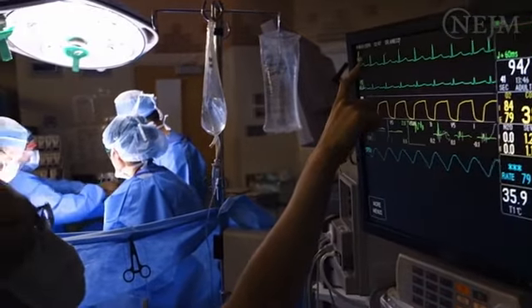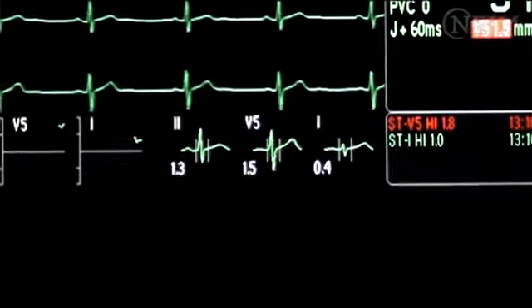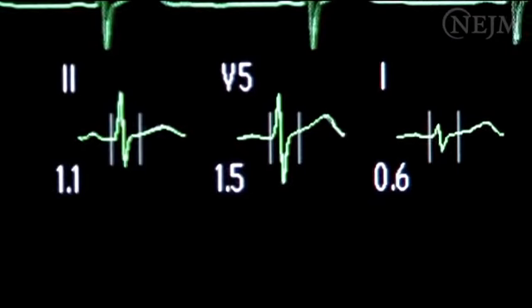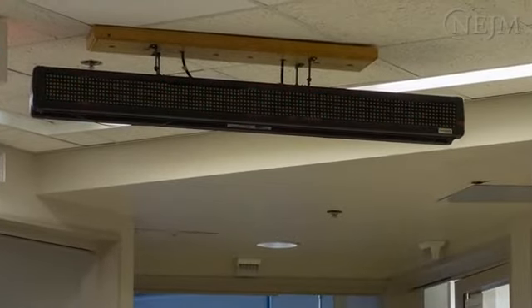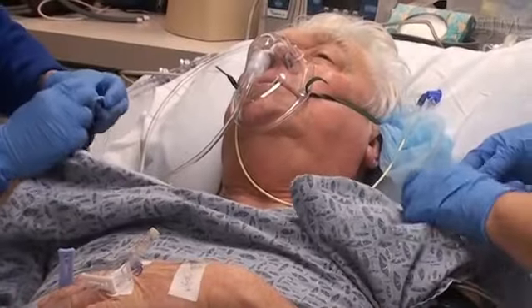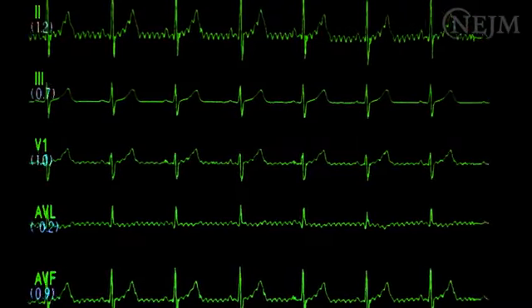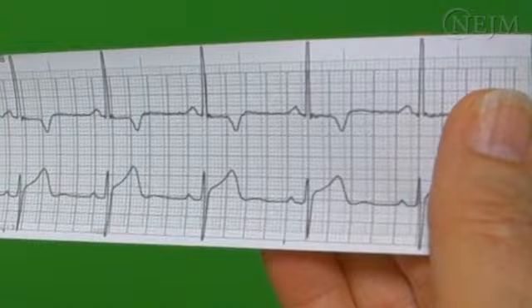Trained personnel are needed to operate the ECG machine and to interpret its data. The diagnostic algorithms used by the ECG machine have a high sensitivity for the detection of certain conditions, but because the machine's specificity for these conditions is relatively low, overtreatment is possible. ST segment alarms, for instance, can be misinterpreted as myocardial ischemia. As a result, myocardial ischemia may be overtreated. Other situations of misinterpretation and possible overtreatment include those in which low-amplitude muscle tremor or a noisy baseline is interpreted as atrial fibrillation. Therefore, healthcare providers must use their clinical judgment when interpreting the data.